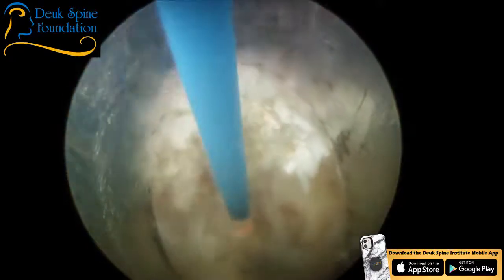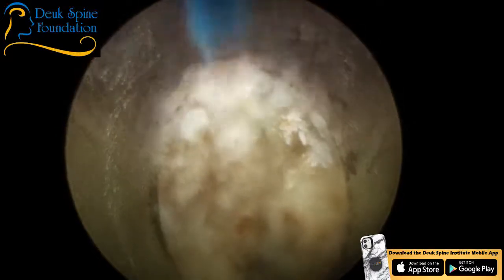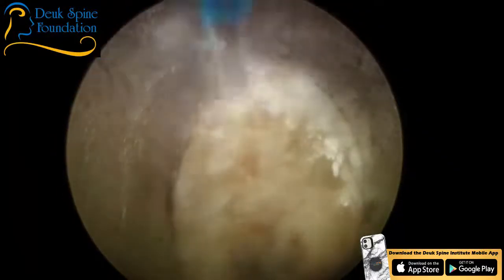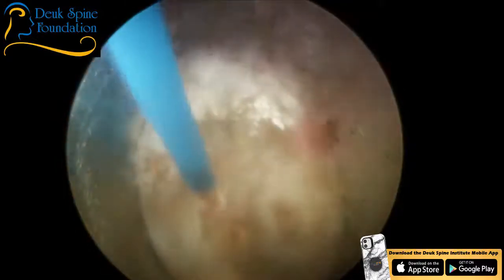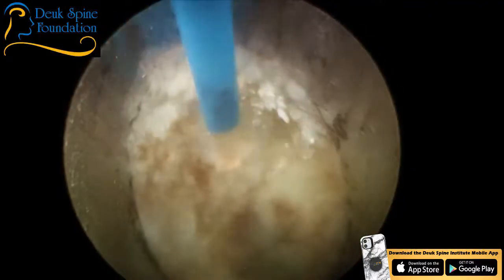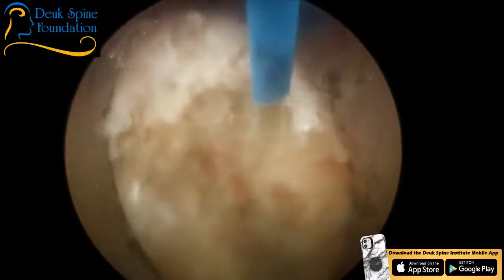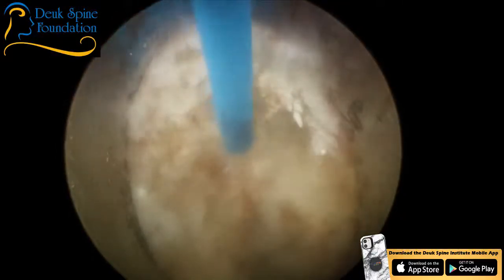So remember when we did the discogram, we didn't get a big tear out to the periphery with the dye, but the tear is there. This is it right here. So what's happened? Well, it's healed. I mean, it's partially healed, right? And so that scar tissue has closed the tear over the years, but it's still a painful tear. That's why we have to come in and debride it. By debriding the painful tear, it should take away the back pain that he had. And if I were to do another discogram tomorrow at this disc, I believe the pain would be completely gone at L5-S1. He would have zero pain.